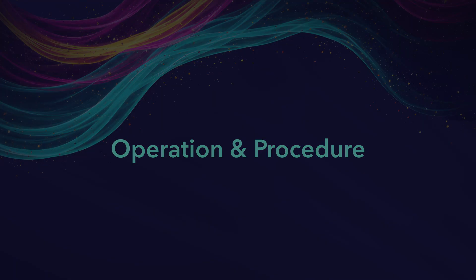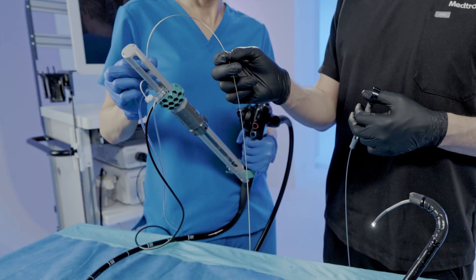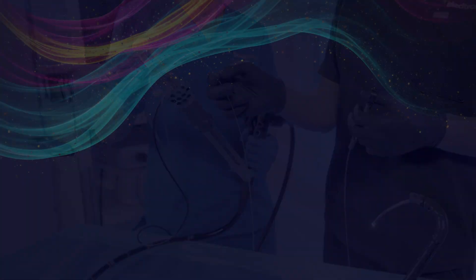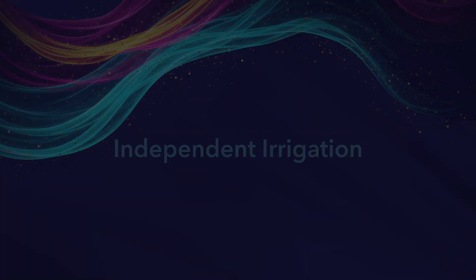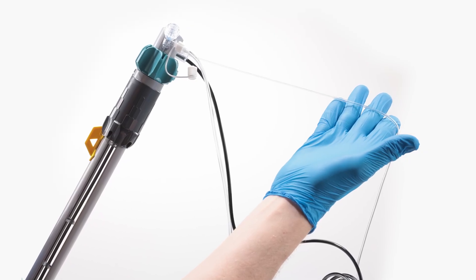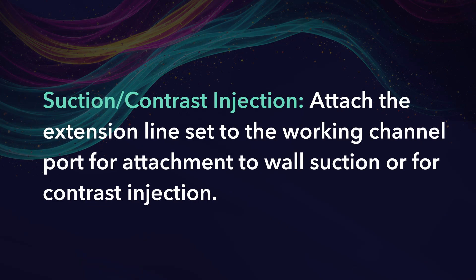Operation and Procedure. Accessory Insertion. Insert devices through the working channel valve while monitoring live video. Independent Irrigation. The DPS has dedicated irrigation channels. Connect foot pedal irrigation to the irrigation port and use as necessary. Suction and Contrast Injection. Attach the extension line set to the working channel port for attachment to wall suction or for contrast injection.